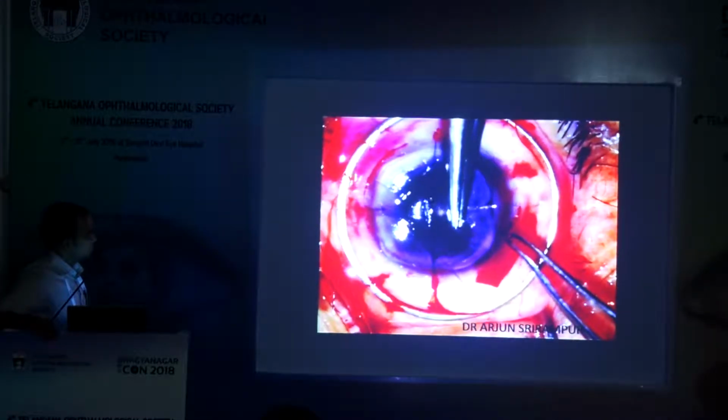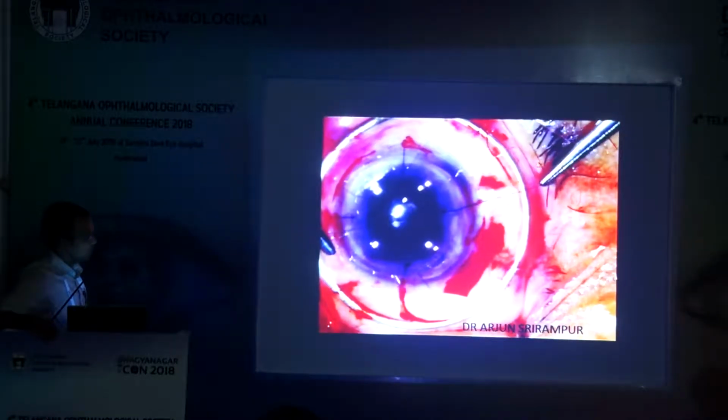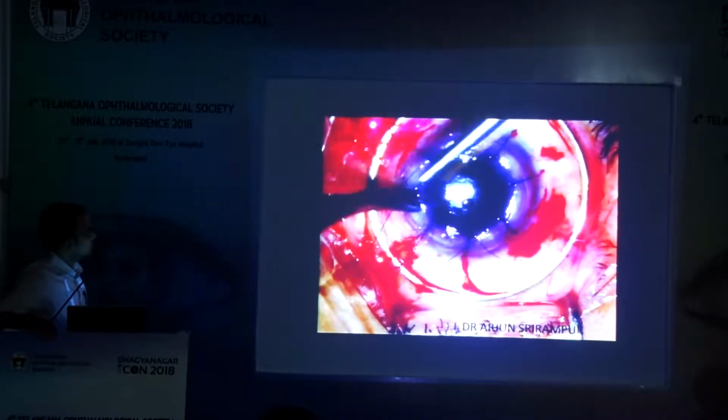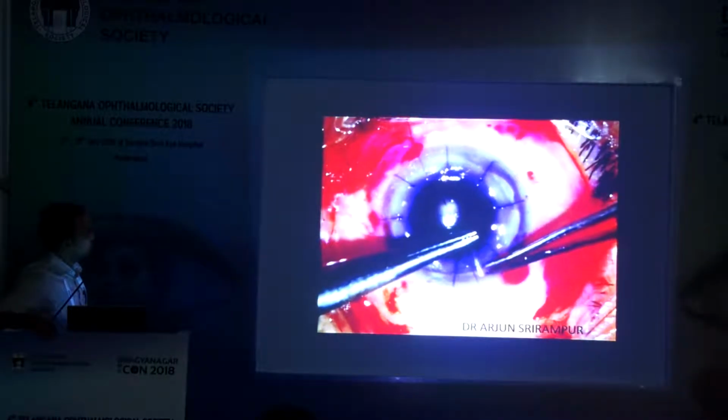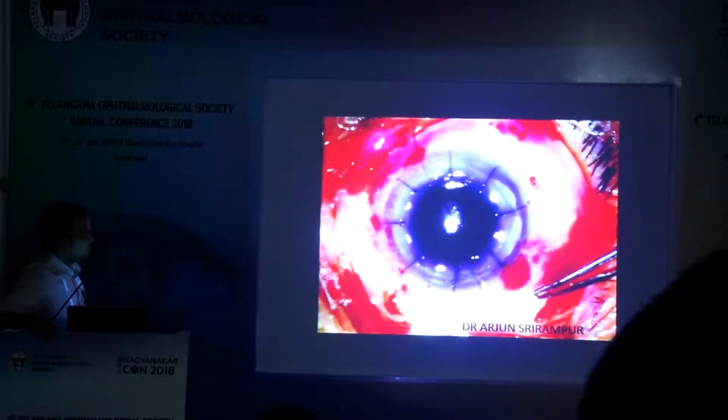First we put anchoring four sutures. The superior is put first. The inferior part is taken care that we have an equal division of the tension on the tissue. Then after putting 8 sutures, the Flieringa ring is removed, and the rest of the 8 sutures are finished.